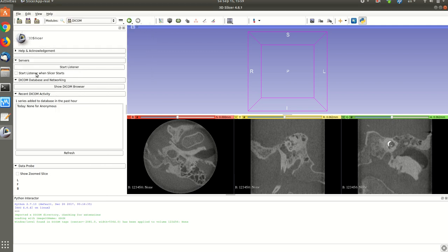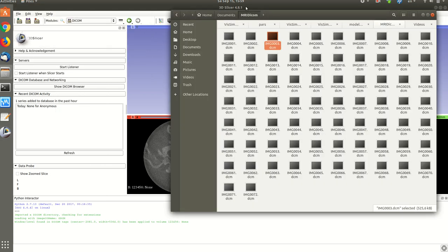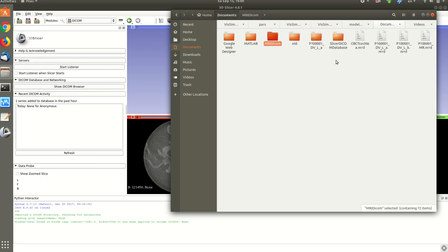And if I go now to my documents, I can see that the NRRD that I just created is already there.